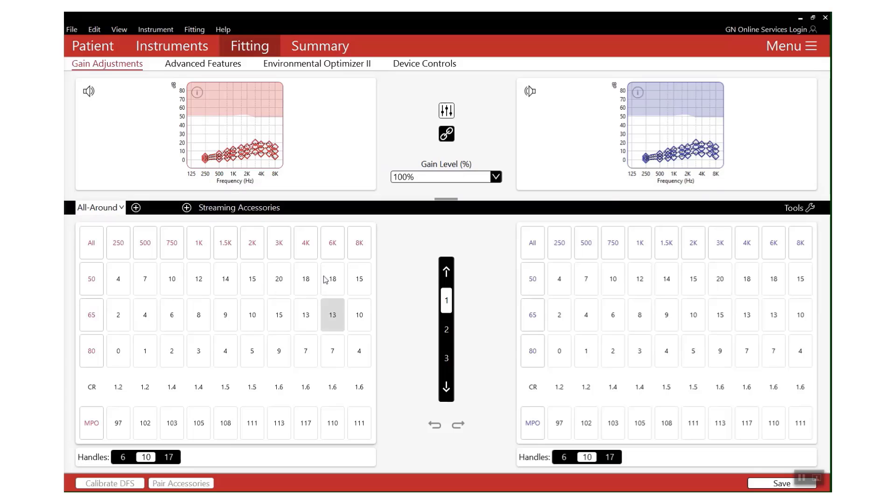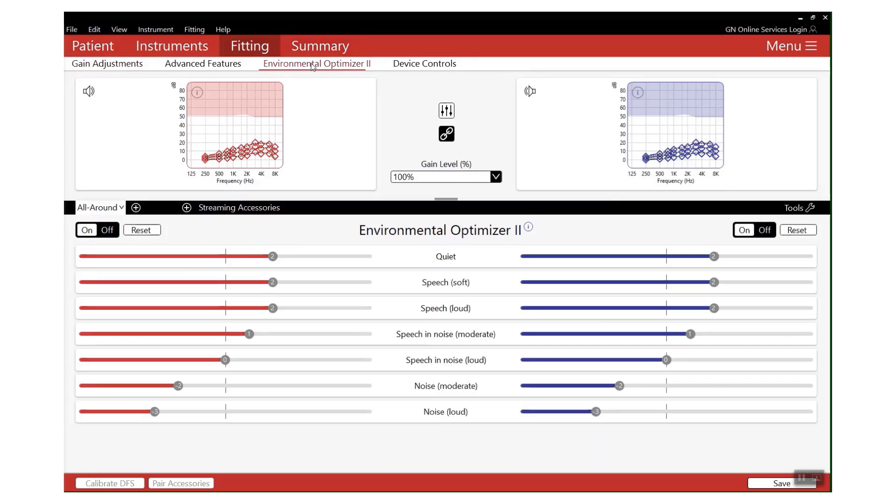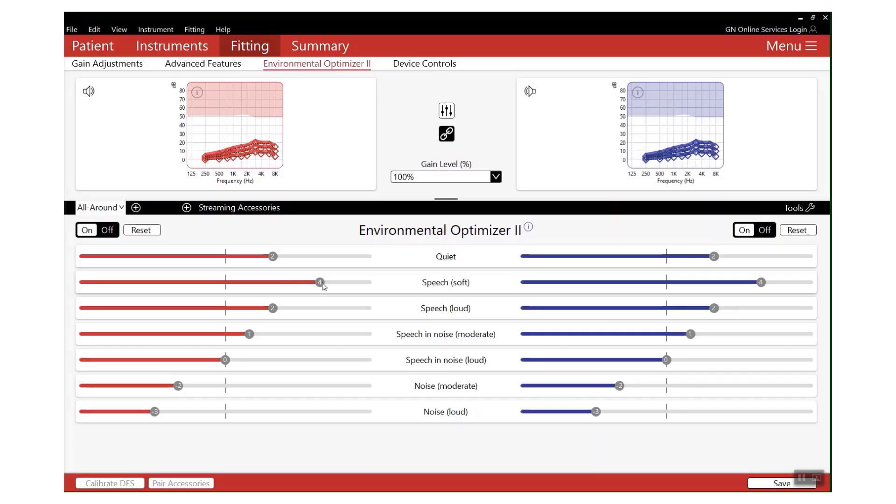You can go into Environmental Optimizer or Environmental Optimizer 2 and increase the gain specifically for soft speech at a level that's comfortable for your patient.